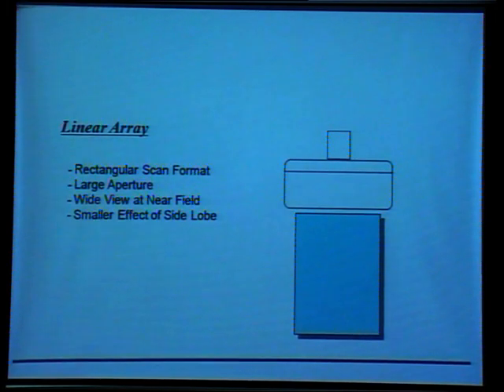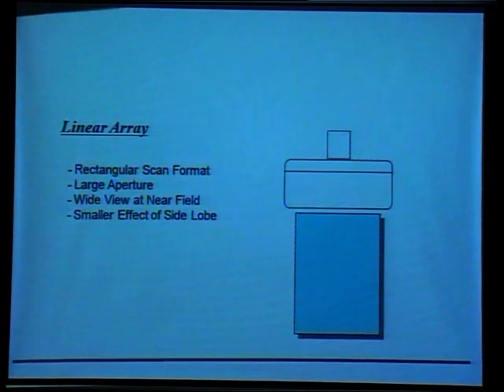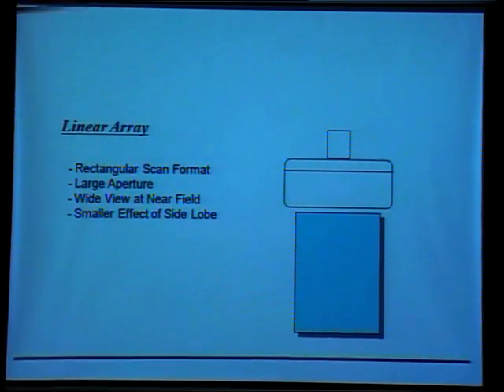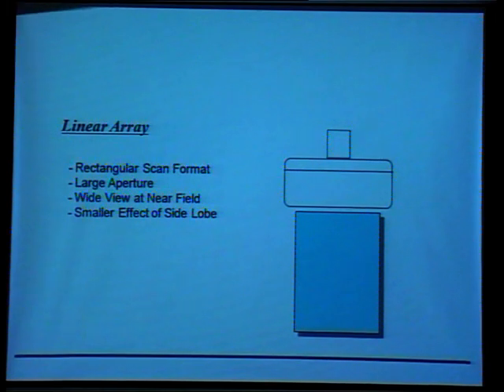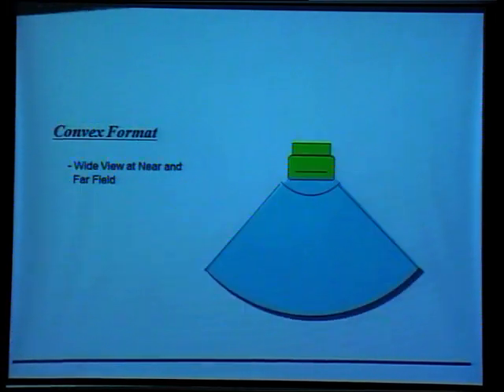So the frequency of these peripheral vascular transducers is very high. They are 10 to 16 megahertz. They give me strong resolution, but the penetration is very less. That's why we do the peripheral ultrasound with linear transducers, long ones.